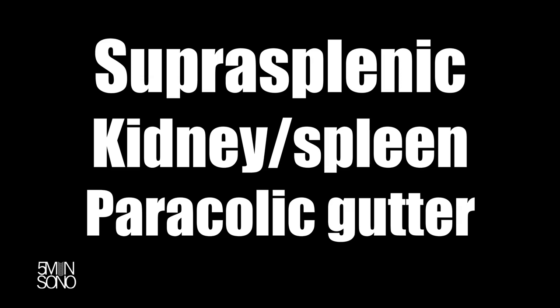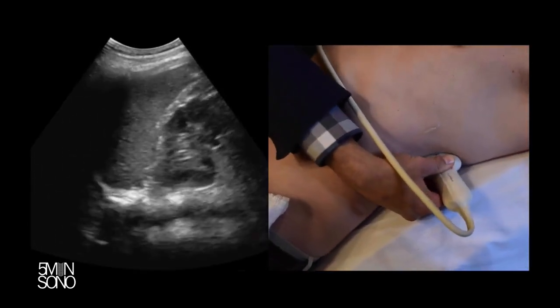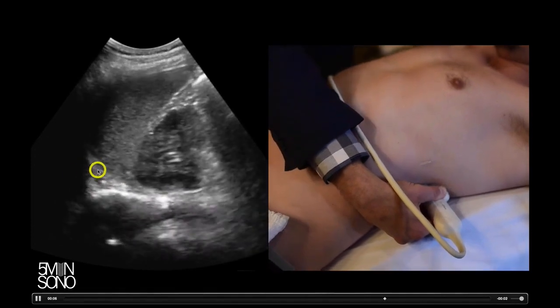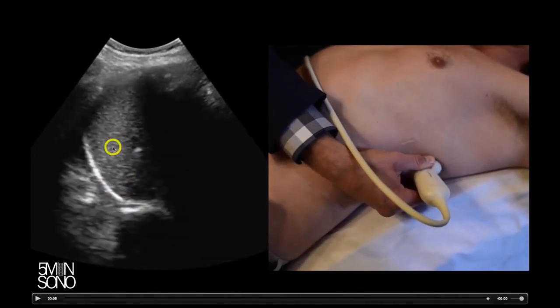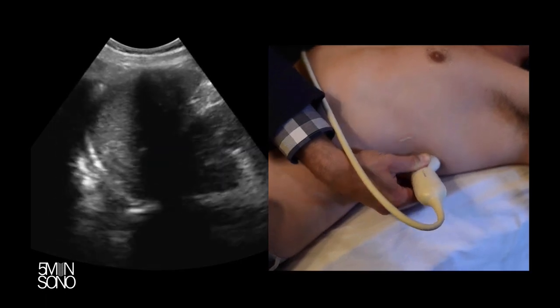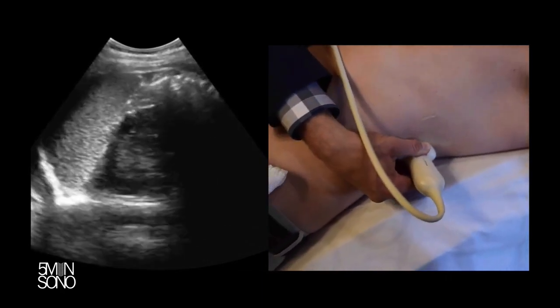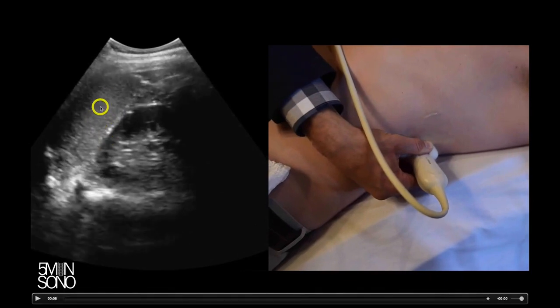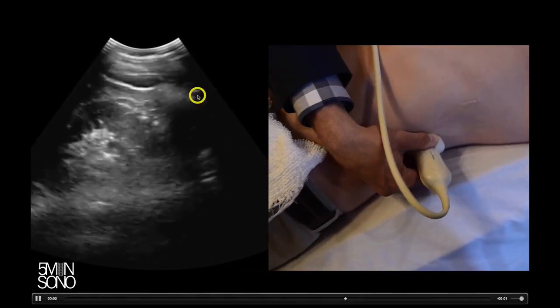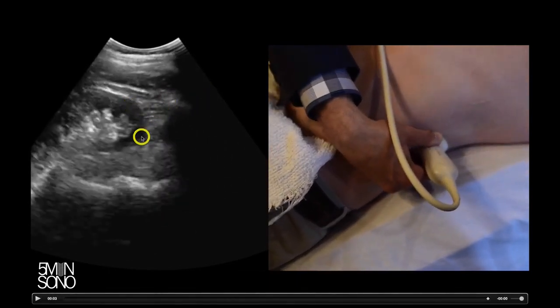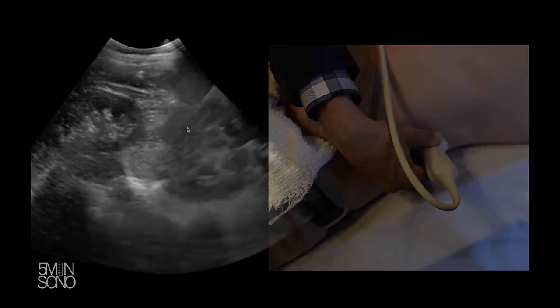With the left upper quadrant, there are also three different places you want to look. It's similar to the right upper quadrant, but the place where fluid is more likely to accumulate is actually a little different. The most important spot is actually suprasplenic — you want to look above the spleen, between that white line and the spleen. That is where fluid accumulates more commonly. You still want to look in more than just that place, because this is a 3D organ and fluid can accumulate wherever it happens to. So you want to look between the kidney and the spleen, and also in the paracolic gutter at the inferior pole of the kidney and the caudal tip of the spleen.